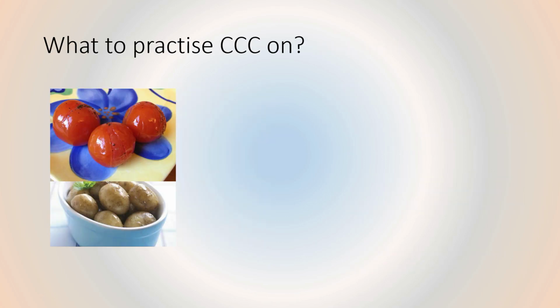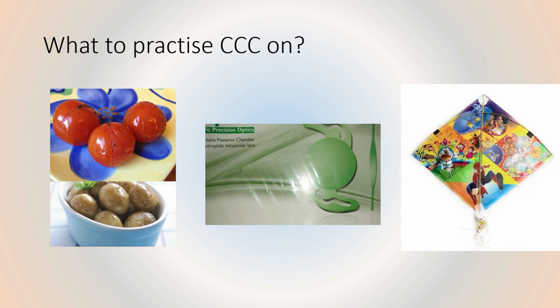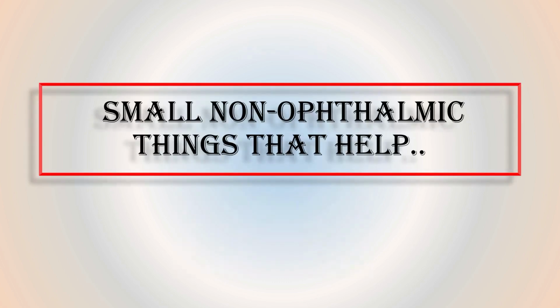What do we practice it on? Boiled vegetables. The cover on the IOL box. My personal favorite, the stretched plastic kite. Finally, it's a game of numbers. The more we do, the better we get.